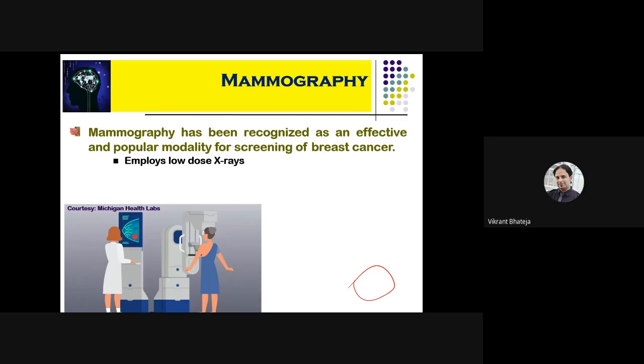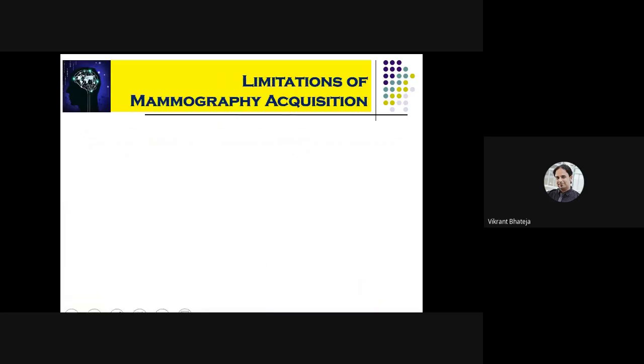So that is another challenge over there, that you cannot go in for frequent testing. Say suppose you have a doubt, you have had one breast X-ray done, you want to take a second opinion, so you get another X-ray done. Every time you are getting this kind of repetitive screening in a short span of time, eventually you are more exposed to the danger of this kind of cancer. So the reason for choosing this is that it is a low dose X-ray and an inexpensive breast examination.